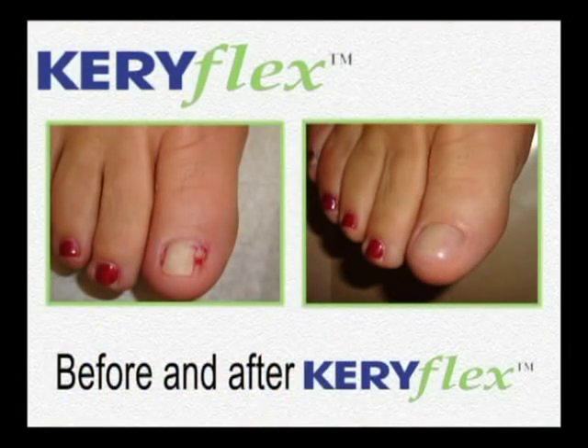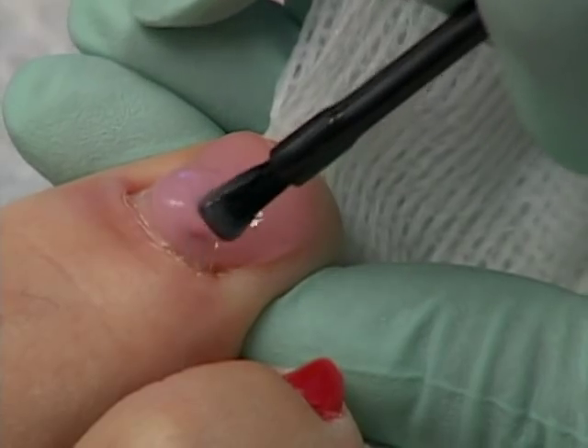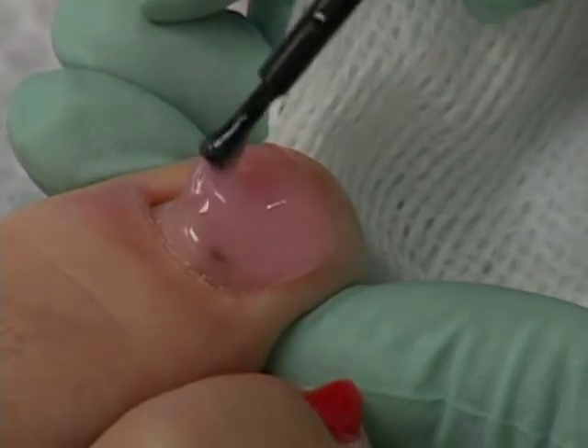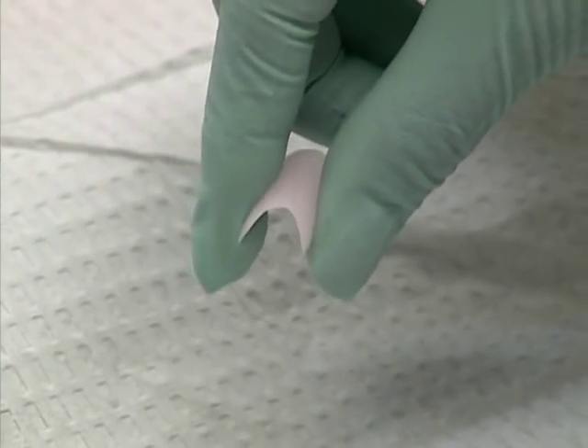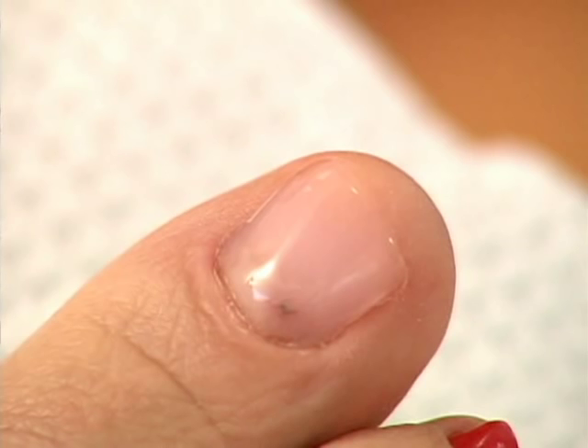Keriflex is a cosmetic solution to the unsightly appearance of these nails. Keriflex uses synthetic resins and special activators to create a durable, yet flexible, artificial nail when exposed to a certain frequency of ultraviolet light. In as little as 15 minutes, you can create a realistic, natural-looking nail in place of the damaged nail.